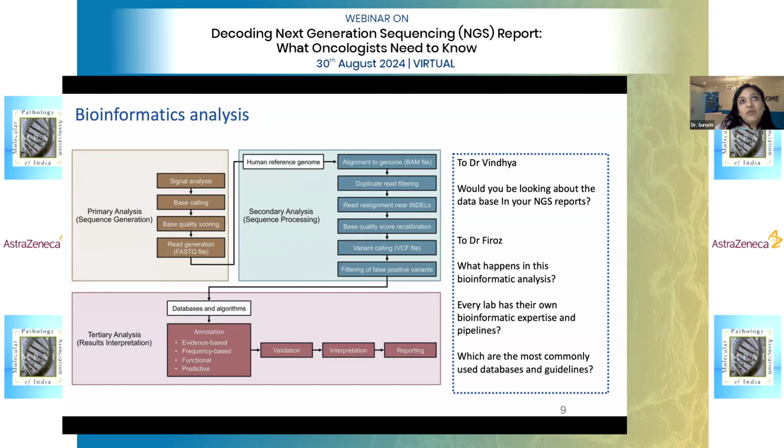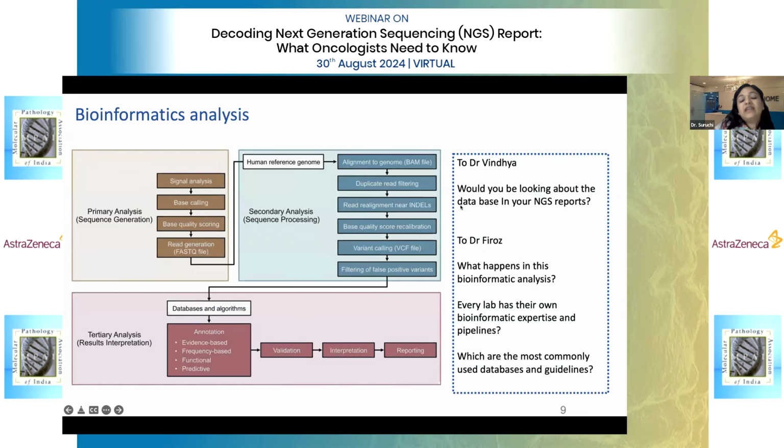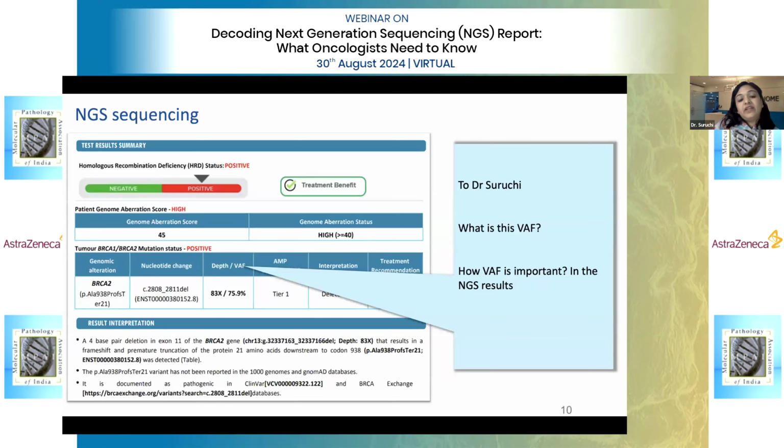But when we use Illumina sequencing platforms, we have to have designed bioinformatics pipelines with quality check parameters, which are defined at the time of those panel validations. It is easier for germline variants. But when it comes to FFPE or liquid biopsy, it definitely needs a lot of customization and optimization and undergoes lots of quality checks. And that's how we have control of the data.